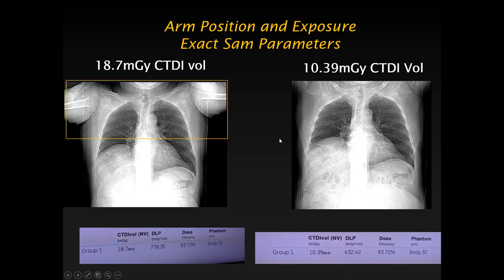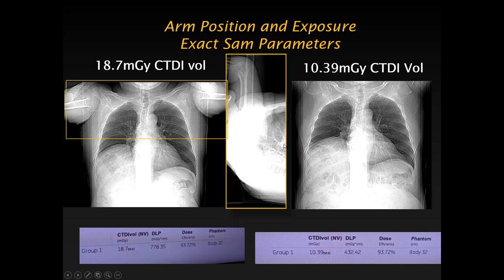Well, why did this happen? Well, it's this region right here. Take a look at the projections that the x-rays will have to go through. Not only is this a denser object that you'll need more x-rays for, but you can see that it's actually projecting through and it's going to magnify because the patient's center is over here and this is all the way up here.